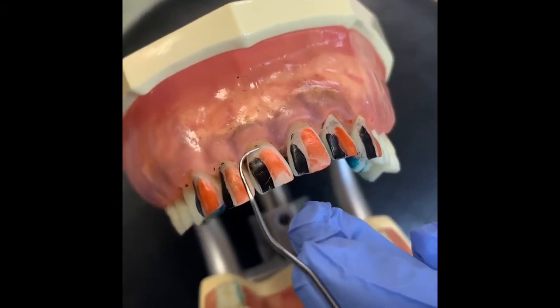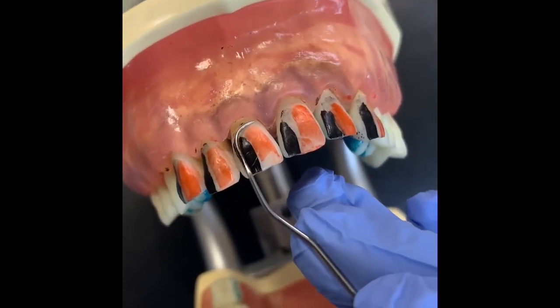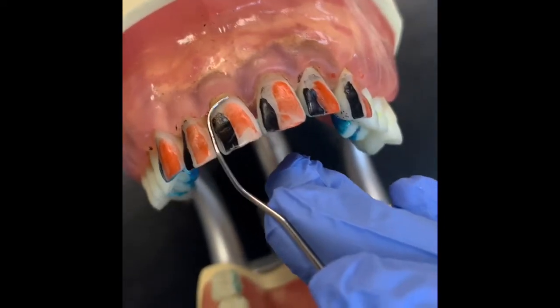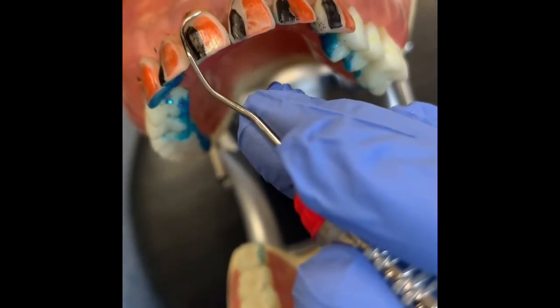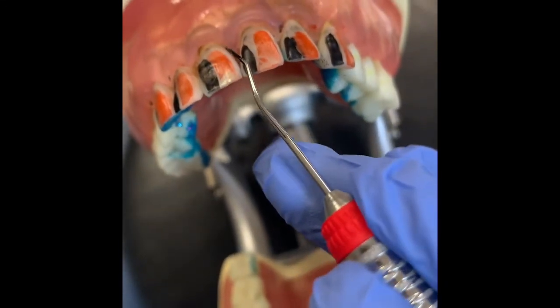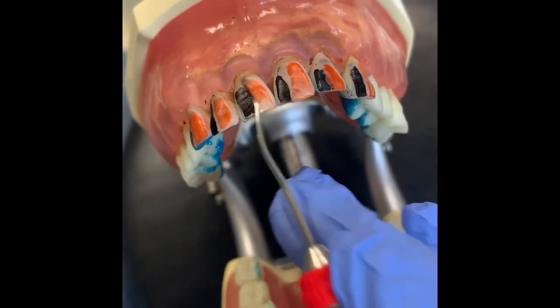So I'm adapting here, surfaces away, the orange. So if you look at the tip of my Explorer, you see that the tip is poking up, let's come here, into the gingiva. So that is the wrong end. That end is not correct for surfaces away. You see here, it's not crossing the middle of the tooth.